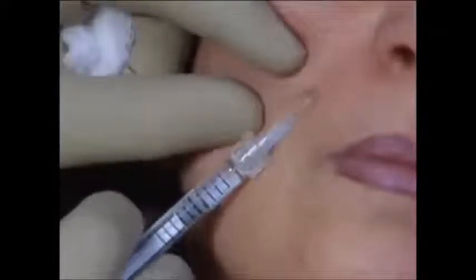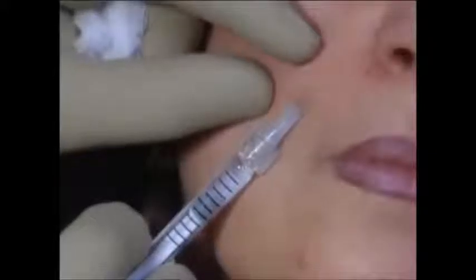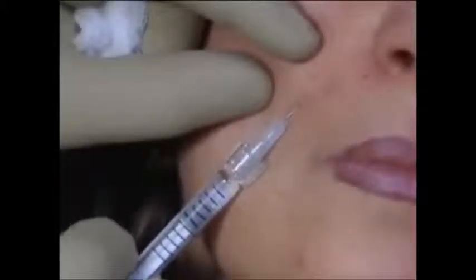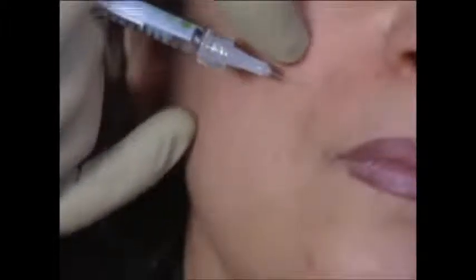The lower nasolabial fold also needs to be injected, and as you can see, there are different levels of atrophy of the soft tissues and of sagging. Again, a linear threading technique is used in this area, and massage is necessary to smooth out any isolated accumulations or deposits that would cause an irregular bump.